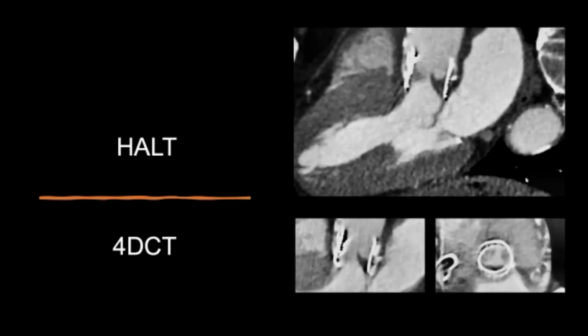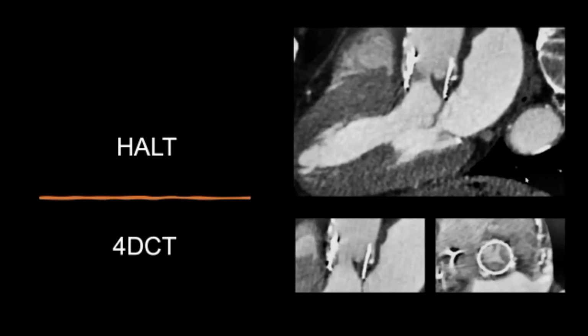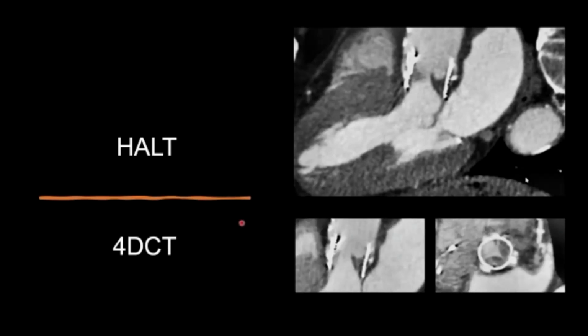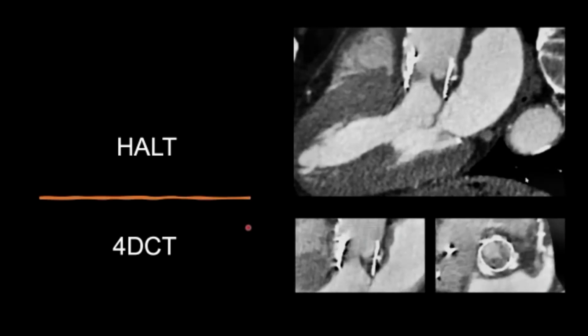It looks like 4D CT is some sort of a science fiction tool, and we're getting these questions all the time. Can you do 4D CT? What is this 4D CT? What's 4D representing? And we tell everybody that essentially you can do this even with the previous generation scanners, and essentially there's a cine angiogram of all the phases in the cardiac cycle.